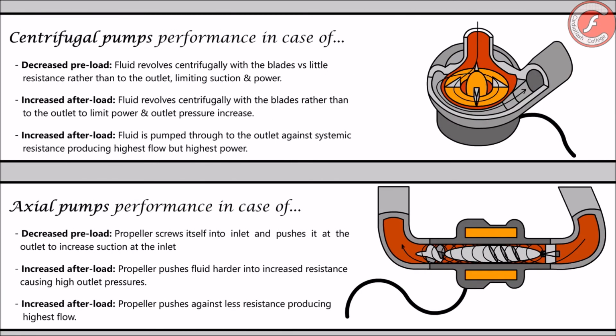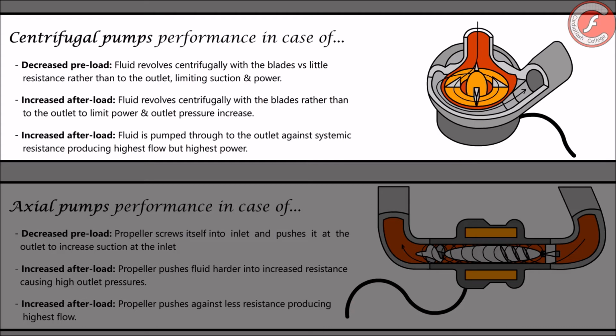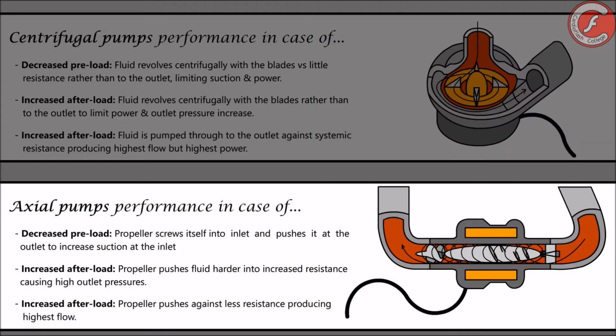Complex, right? Well, let's talk now about the rotor and how it influences the hydrodynamic behavior of the device. As you know, we find two types of continuous flow devices, those with centrifugal flow and those with axial flow. Centrifugal continuous flow LVADs are made up of a rotating disc with obliquely arranged metal plates, which move the blood tangentially through it and generate a perpendicular flow with respect to itself, while continuous axial flow LVADs work by means of a helical rotor that is arranged along the system, being capable of generating a longitudinal flow that begins at the inlet port and ends at the outlet port.